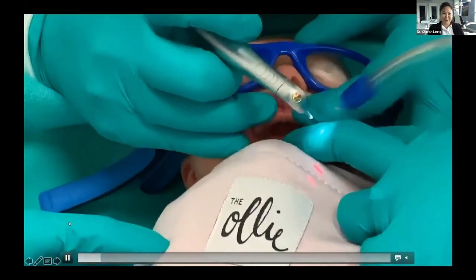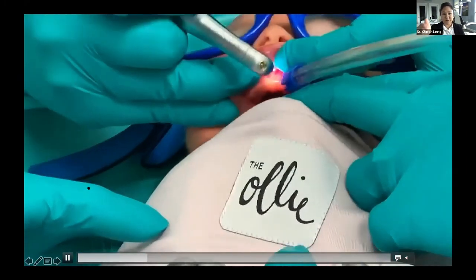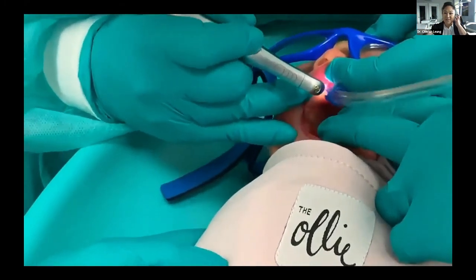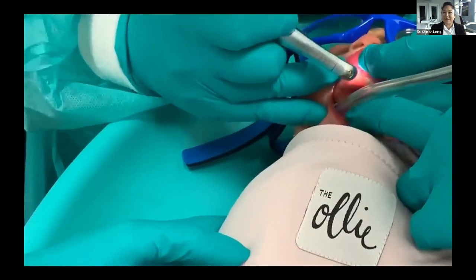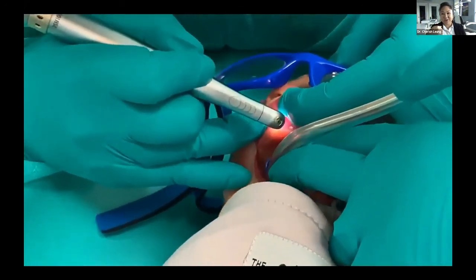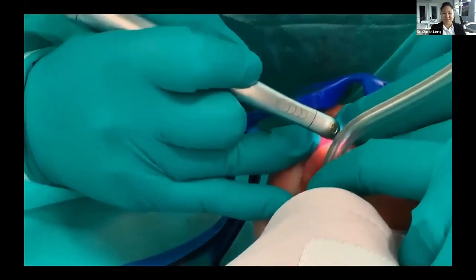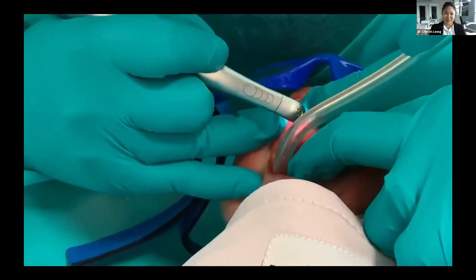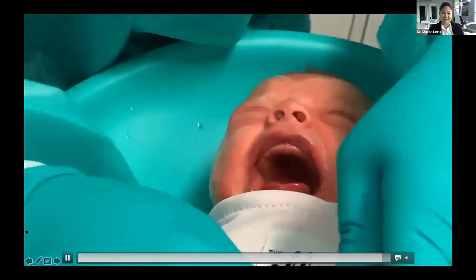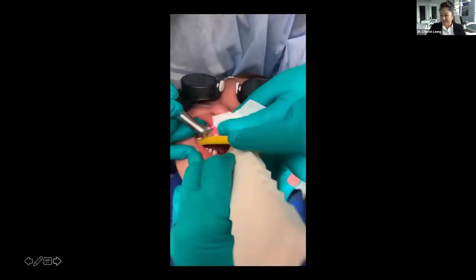All right, and here's how to do it on a little tiny infant. Kiddo's only a few weeks old. So, Ollie swaddle on the Bumbo. These are before I got my awesome Toggle glasses, so they're a little less stable goggles, but super fast. I did a lip release here, up and down vertical, and we don't even really have to prop this little one open because he's pretty much crying, so it's okay. And just suction. Done. Super fast and easy. And then I also did a tongue tie release on him, able to eat and do everything really, really well.